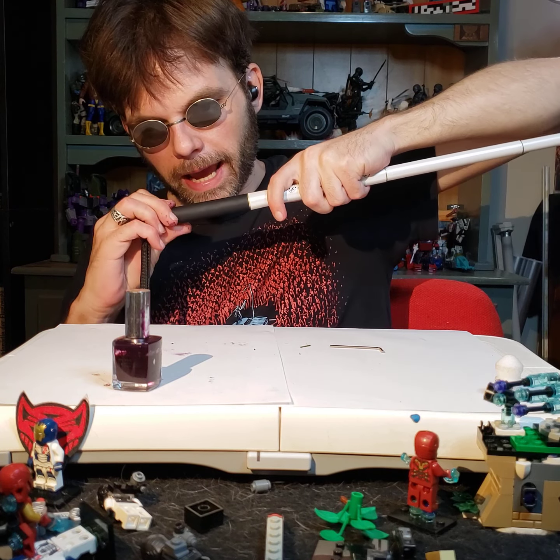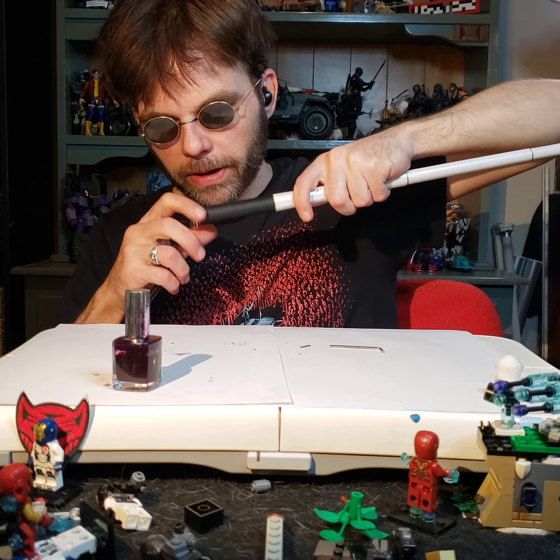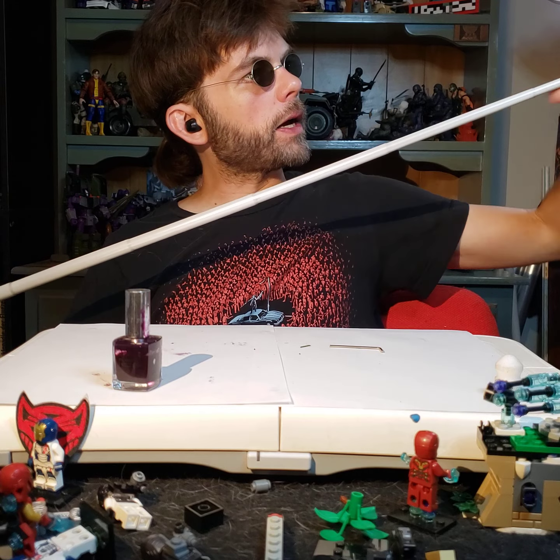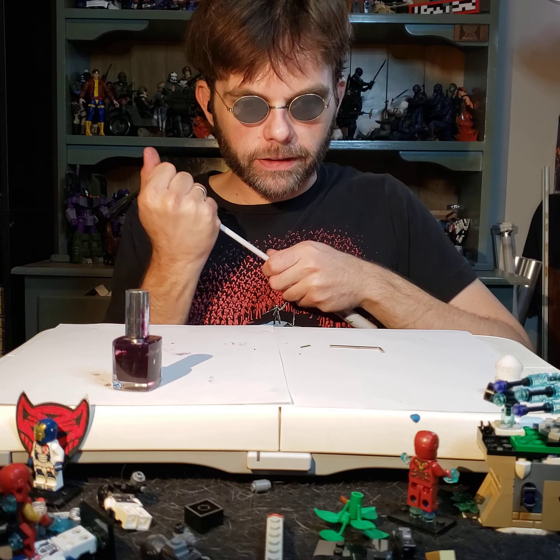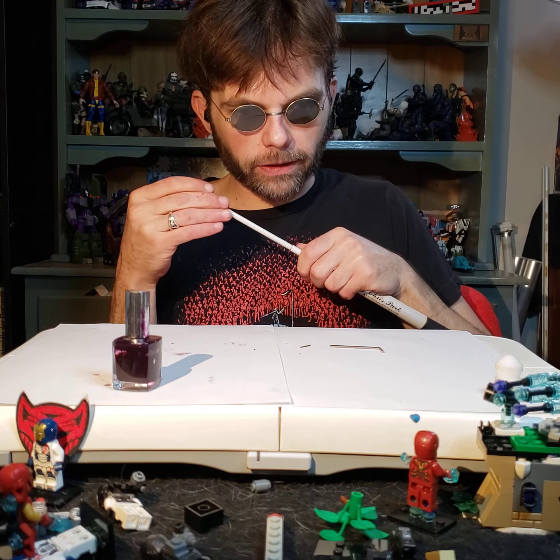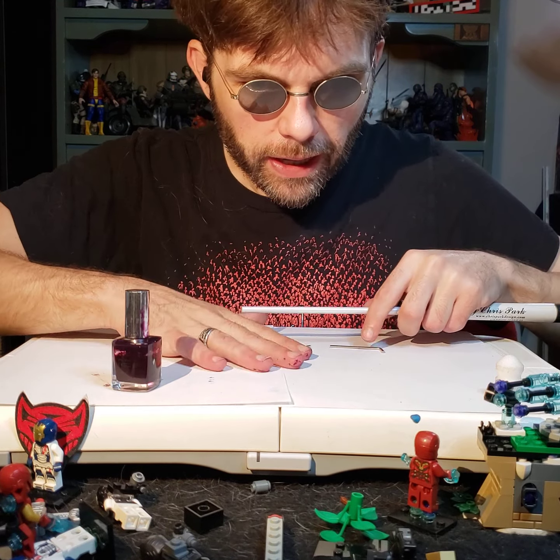So let's go ahead and add the cap here. Screw that baby on there. There we go. Make sure we screwed it on good and tight. Okay, now let's collapse everything but the very tip end of this guy. There we go. All in, and the tip, there it goes. Oh, that's so good. That is going to be wonderful. Just amazing. I love it.